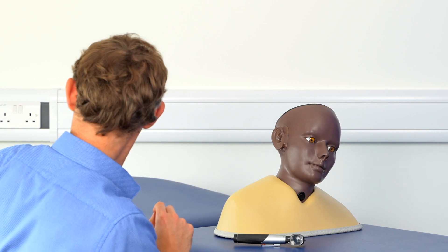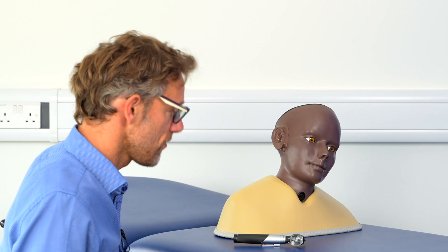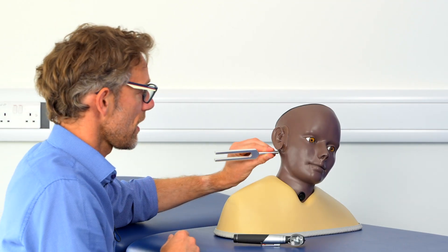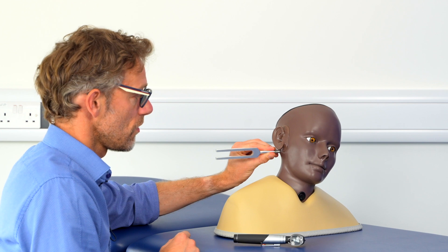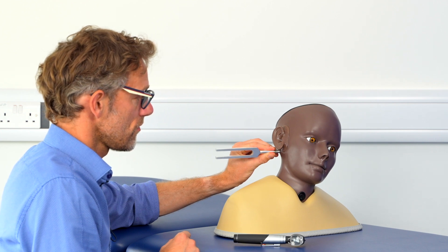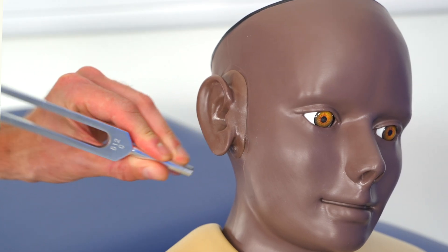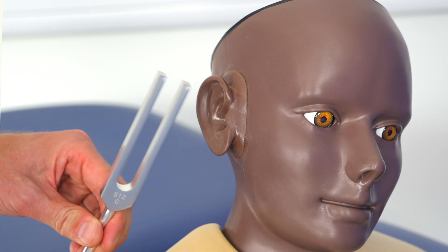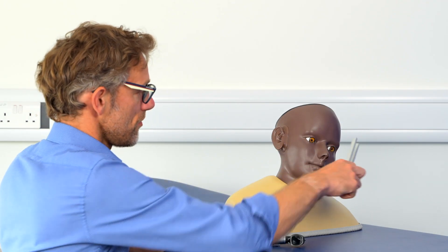Assuming everything is normal there, we're going to get the tuning fork, and I'm just going to place this on the back behind the ear. So tell me when you can no longer hear the noise. When the noise has disappeared, I'm bringing it round again. Can you still hear the noise? Fantastic. And we'll do the same on the opposite side.